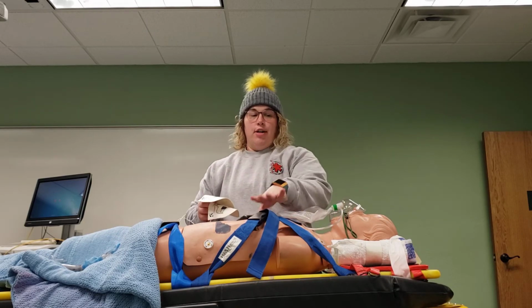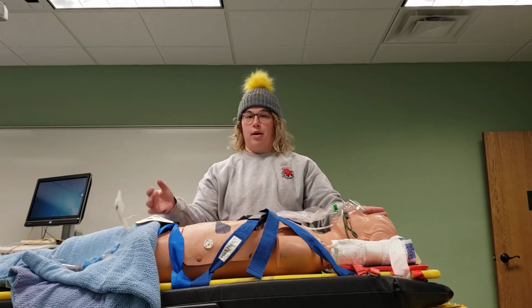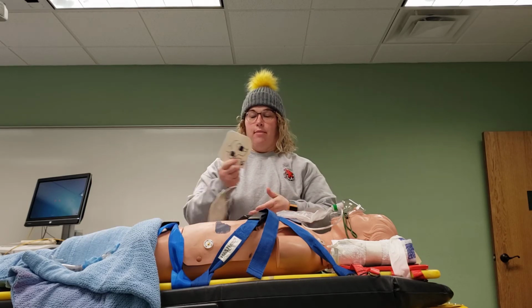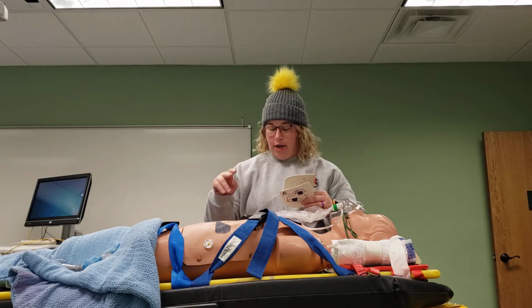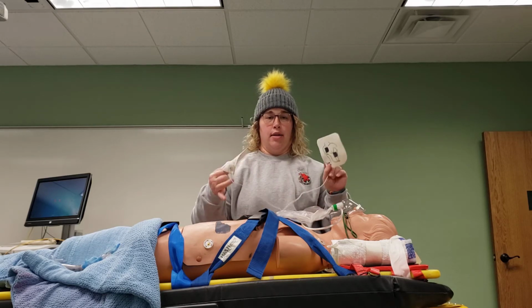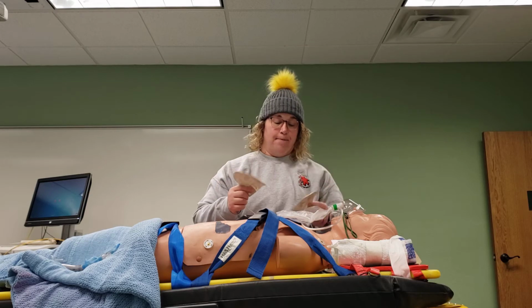So we're doing 30 to 2 breaths, or in the case of you're the sole one waiting for your partner to come running back in, you may just do continuous compressions at 100 to 120 a minute. As soon as we can, we do want to put paddles on them because we know that only two things work in resuscitating patients who are in cardiac arrest. One is defibrillation and the other is quality compressions. Everything else is a guess.